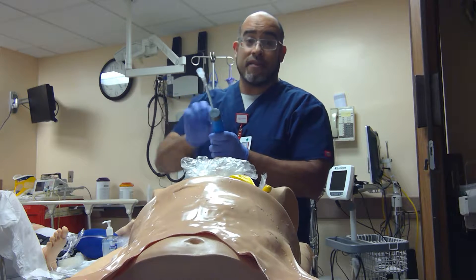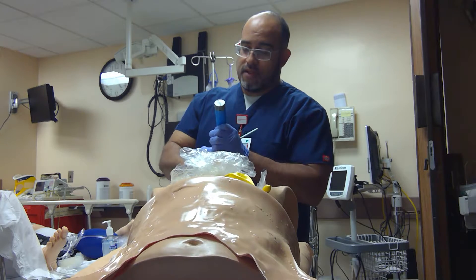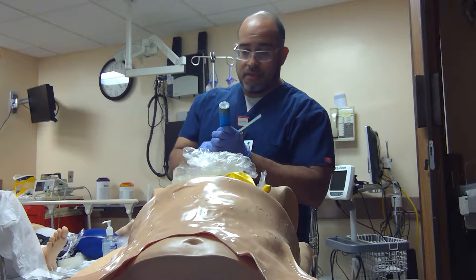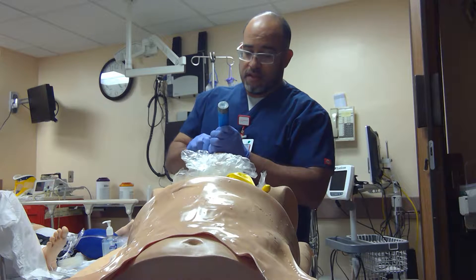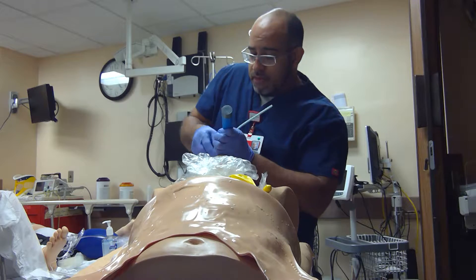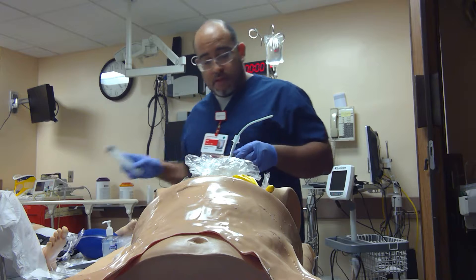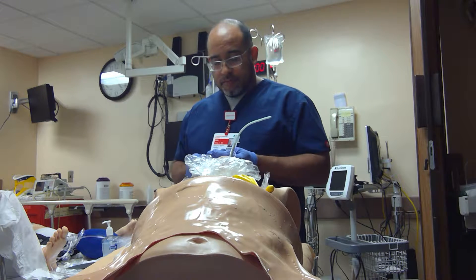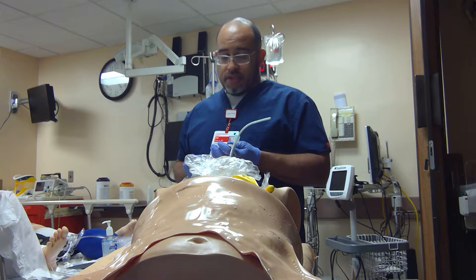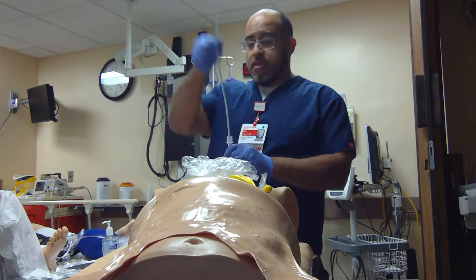This is blind — I'm trying to do what a bronchoscopy would be doing. Let's try to put it as deep as possible. It's getting very narrow here. There's a chance inflating the cuff here is going to inhibit me from passing the tube to the wall.